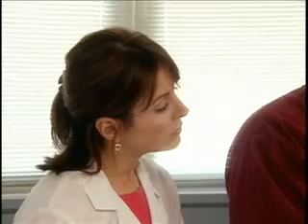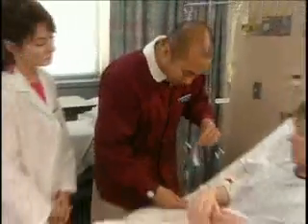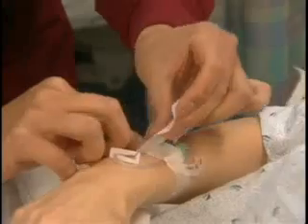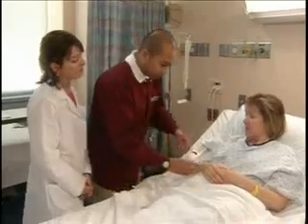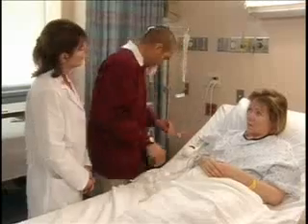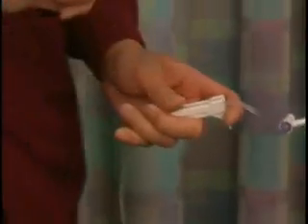Let's secure the IV tubing with tape as needed. And I open the closure clamp on the short extension tubing attached to the IV catheter. Then I open the clamp on the infusion set and adjust the rate.